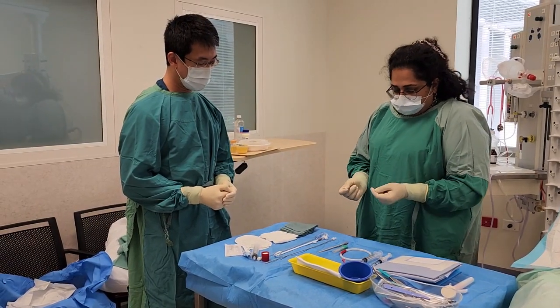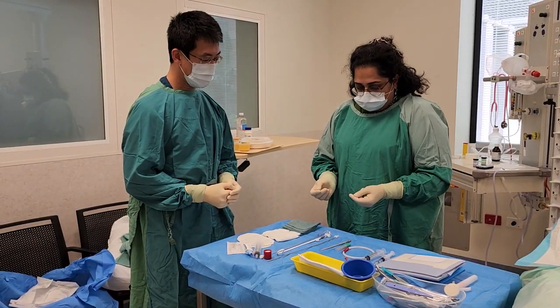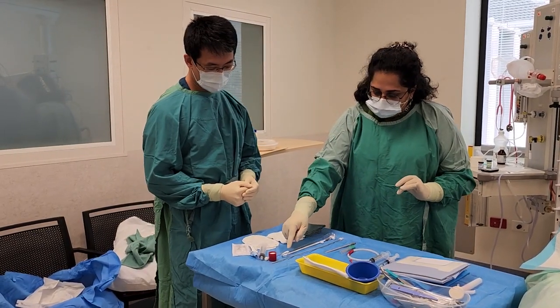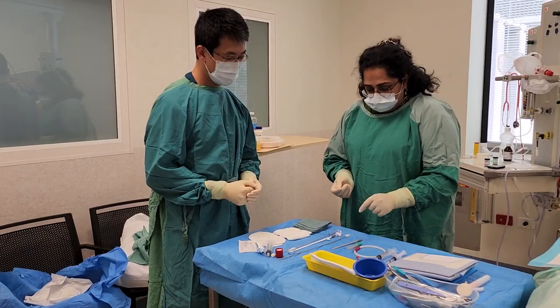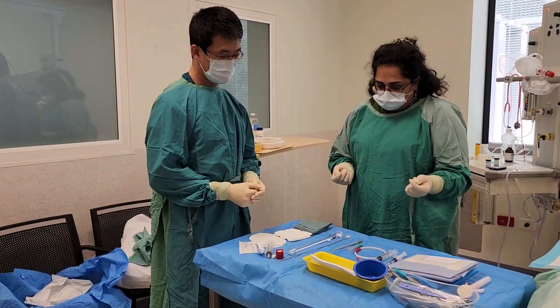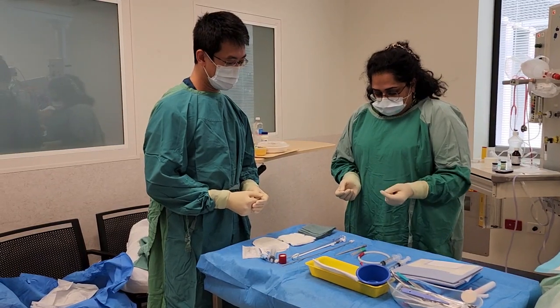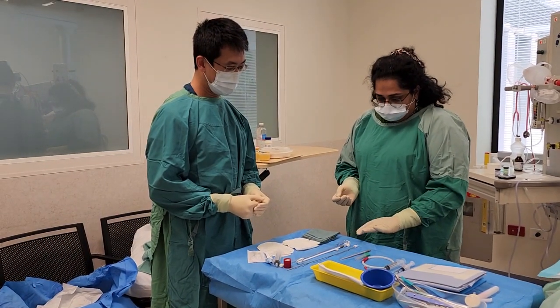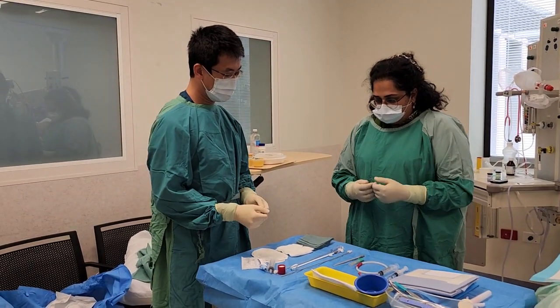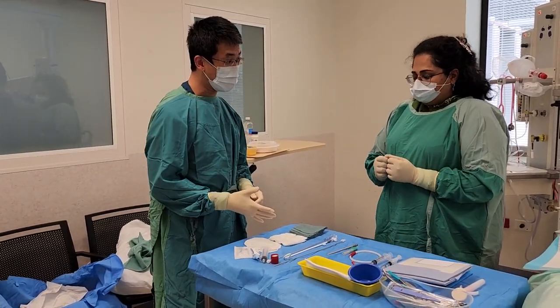Remove the dilator over the guide wire and introduce the pigtail drain, which is here in white. It will have this stiffener inside to straighten out the end of it since it is a pigtail drain. After the drain with the stiffener is introduced into the pleural cavity, we'll remove the stiffener and the drain will resume its pigtail shape. Then after that is firmly in place, we will close the drain while we attach it to the drainage container and then open the drain and allow it to drain. Wonderful. Good. So that's usually the steps we go through.